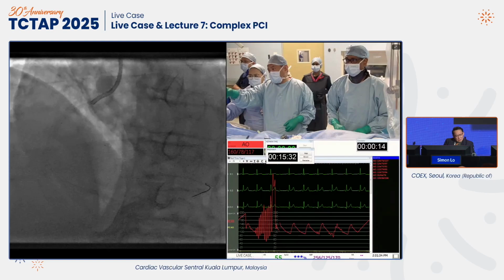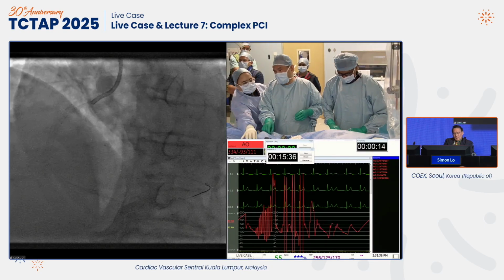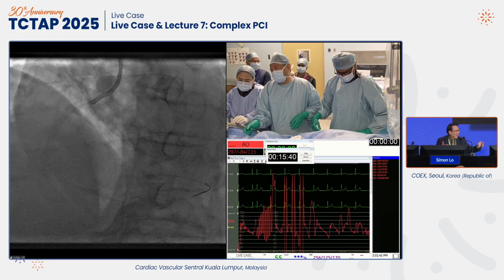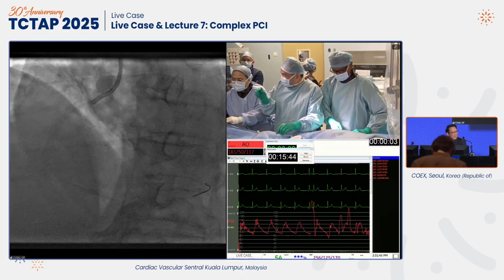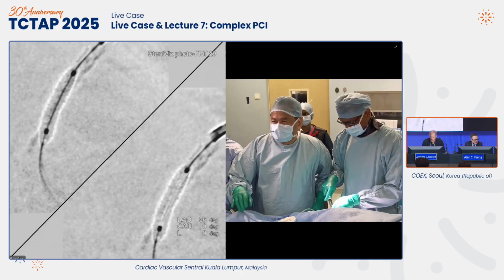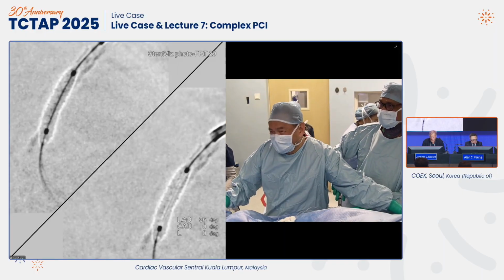Can you see the rows of them? Yes, on the stand. They're very small, tiny. If you lost two of them, you won't know anyway. Well, they assured us it has not happened. Hopefully they'll count it again when you take it out. You have to count it back. Well, I'd be lying if I said I counted them.